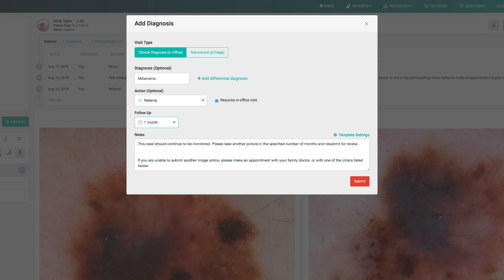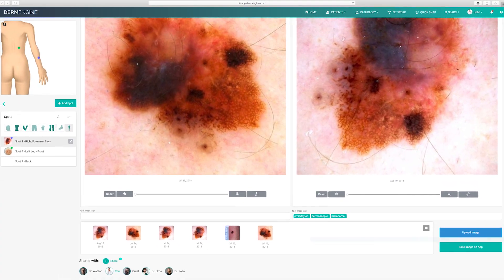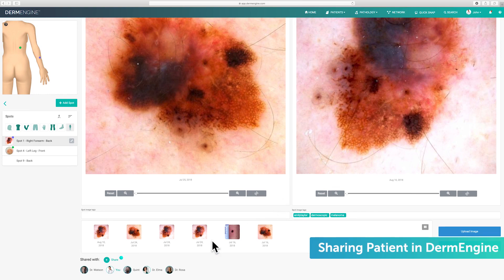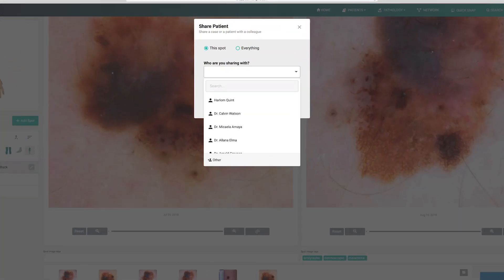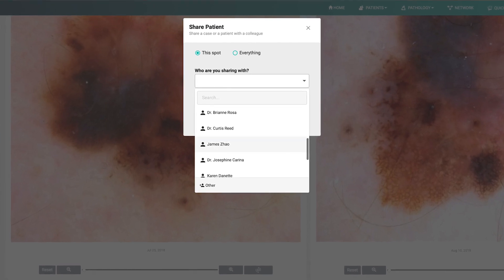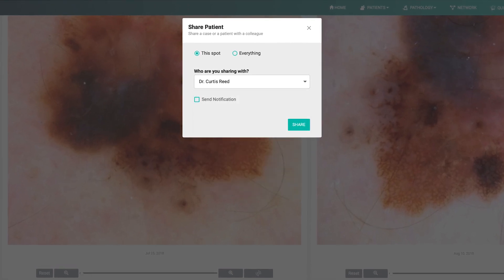Lastly, fill in your notes about the case, which are required. To share a patient, scroll down to the bottom of the profile and press the share icon. This is useful for when you want a colleague such as a pathologist, plastic surgeon, or other specialist to quickly view a patient's case without providing a diagnosis or other type of action.